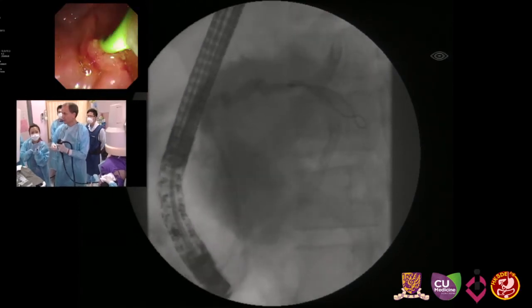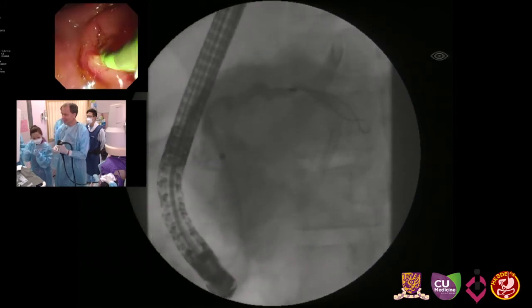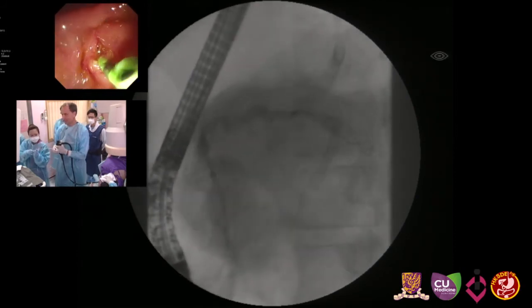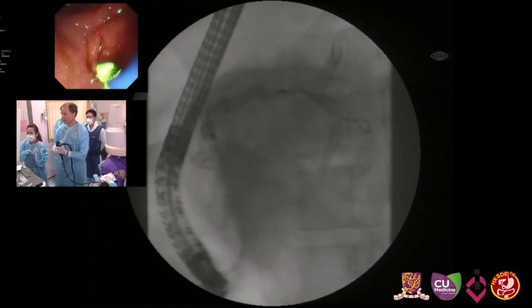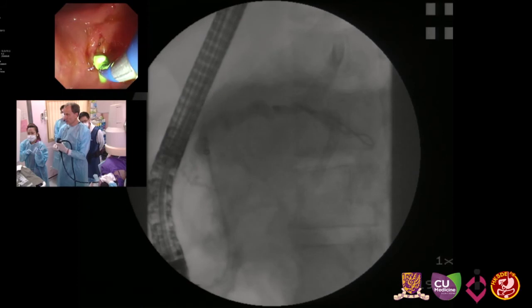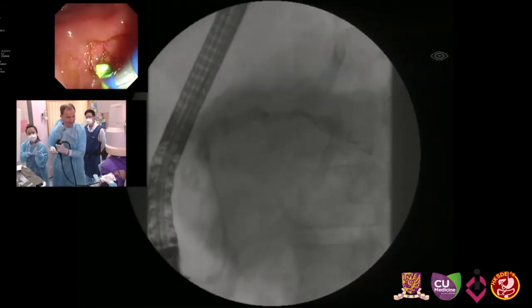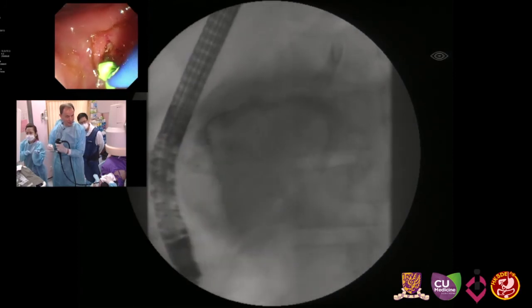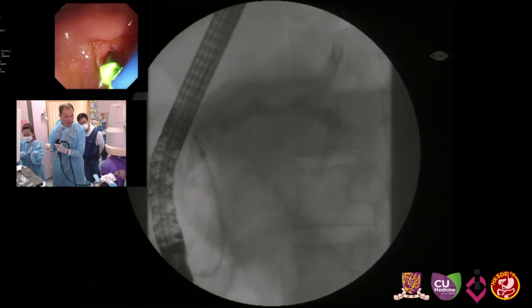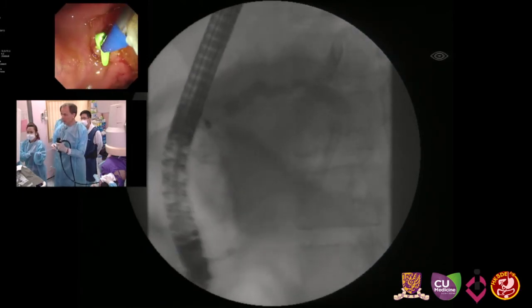I was told this is the usual stent which is placed here, and I think we nicely dilated, so it's probably enough for this third procedure. Sometimes we make the biliary stent with more side holes to use it as a pancreatic stent. Yeah, that's true. So as you can see, the stent is long enough, and now I can pass the stricture, which could be nicely dilated.